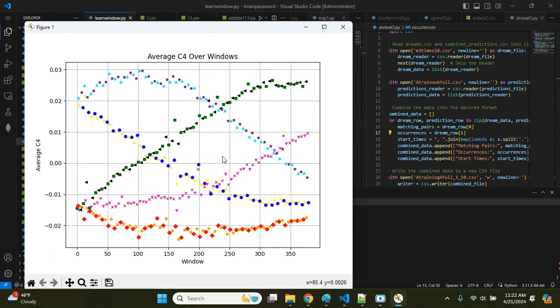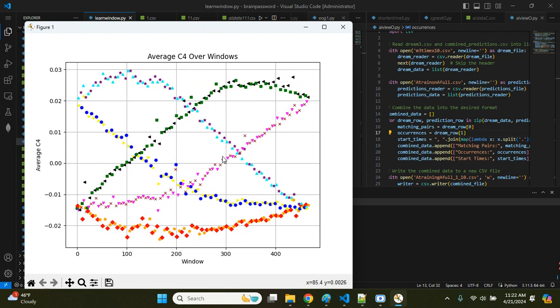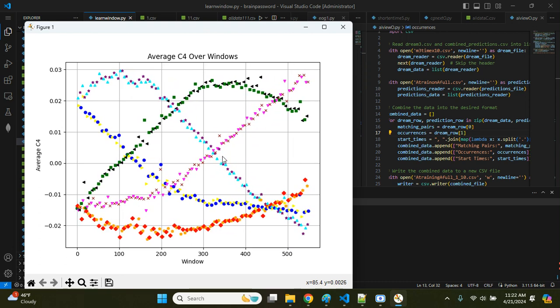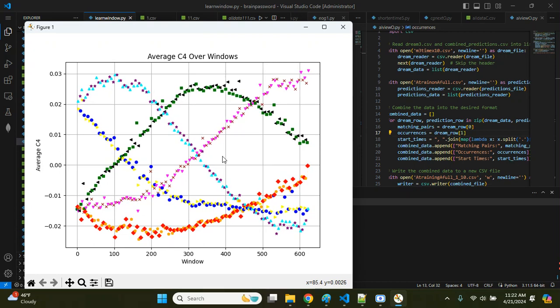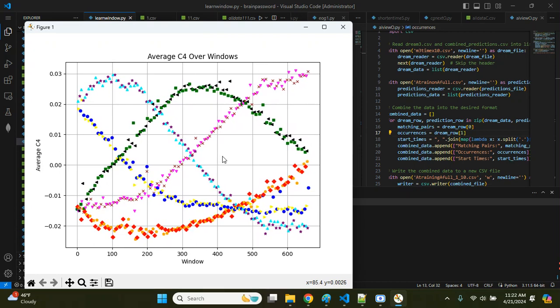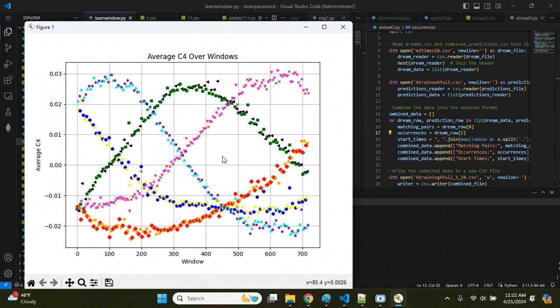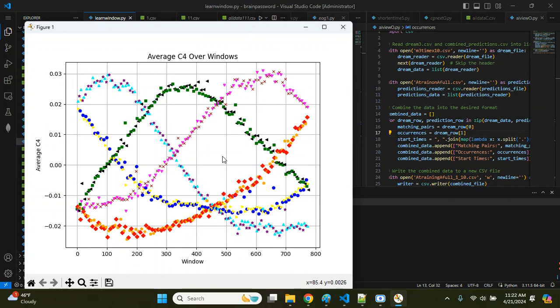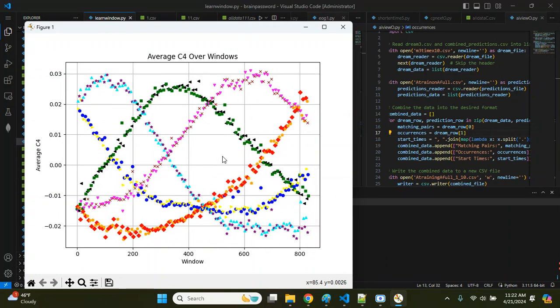And it made this design. It was like, whoa. Just from changing your structure and changing your algorithm, just that small, you can make a detailed map of what's going on in the brain. And that really intrigued me to start doing more research. The research to design this took me about 3 hours.